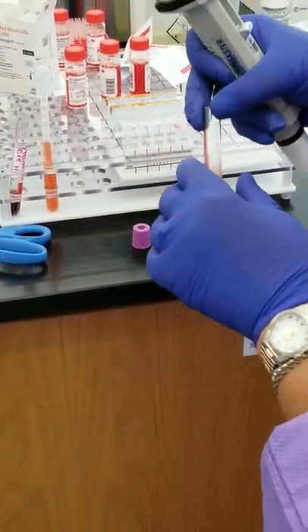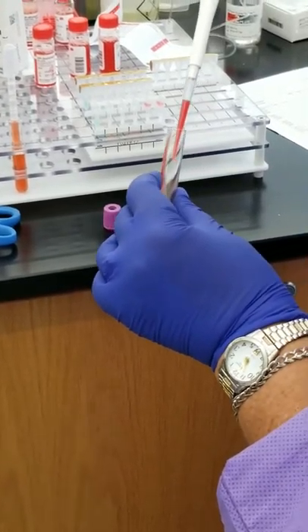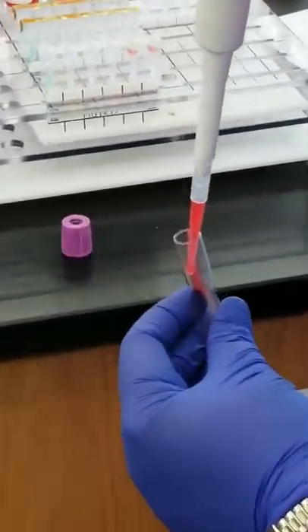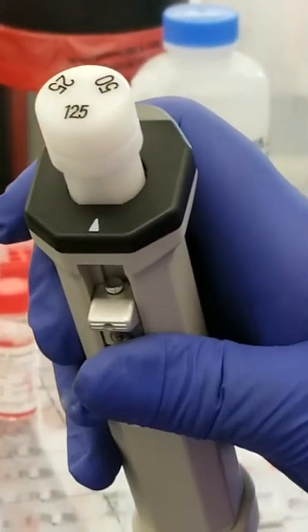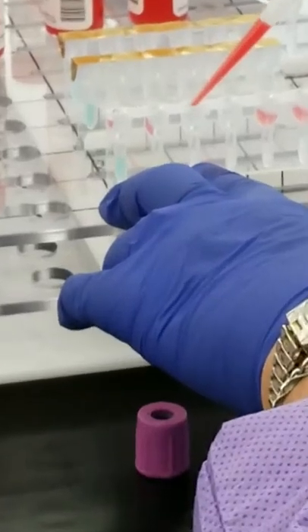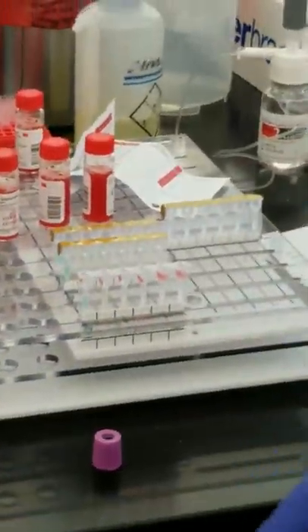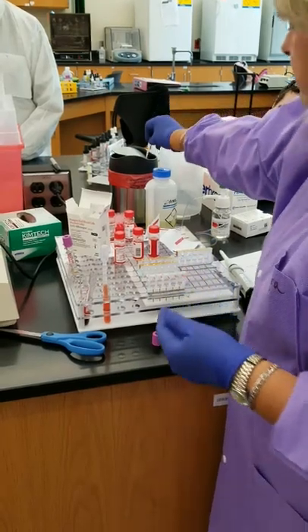So what you're doing is making what should be a 3 to 5% cell suspension. Okay. So you flip your pipette to 12.5. I take my 3 to 5% cell suspension, and I'm going to put 12.5 in the A, B, D, and the control. Go ahead and put it in the control, because if you need the control, it's there. You might as well, but it's not really necessary in most cases.